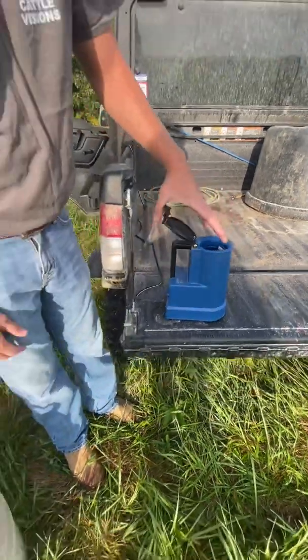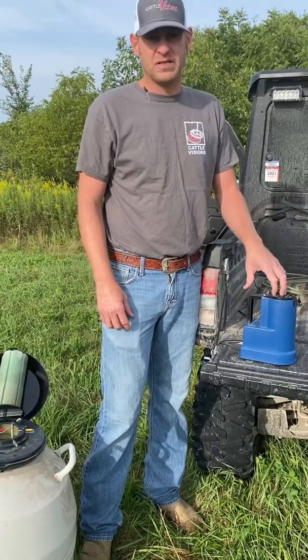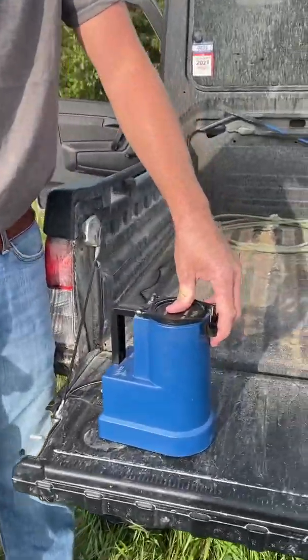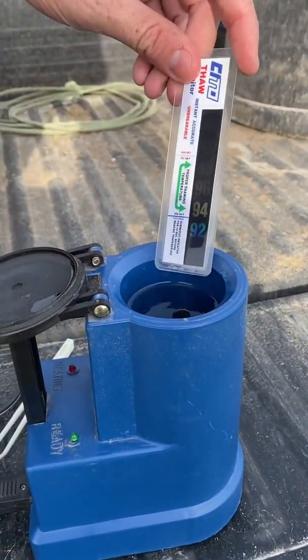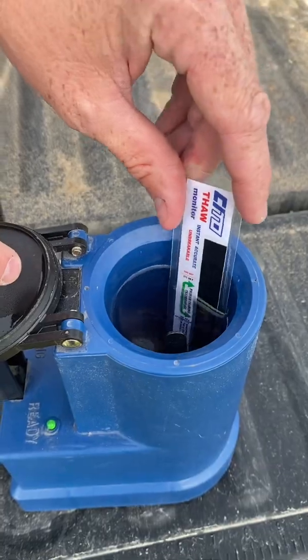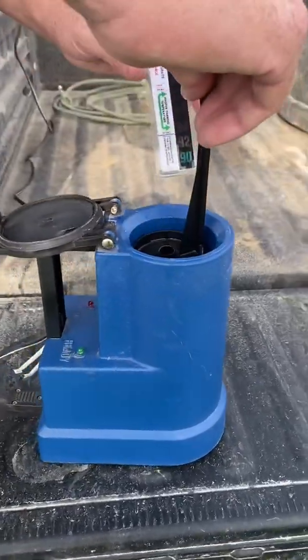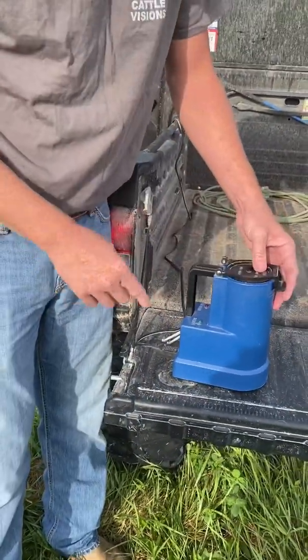I've put my distilled water in and it's come to temp — I have it set at 96 degrees. My green light's on. I just pop the lid open, there's a little card in here showing it's 96 degrees. The water is kind of a neon color — it's hard to see in the sunlight. There's also this tray — if you have a unit of semen you're having trouble getting, you can just pop that tray out and put it back down. No big deal.